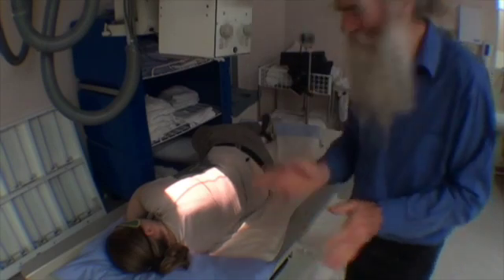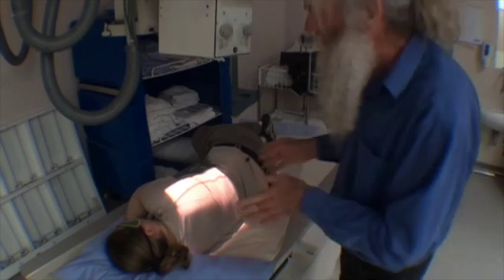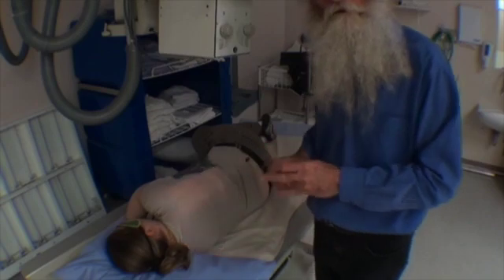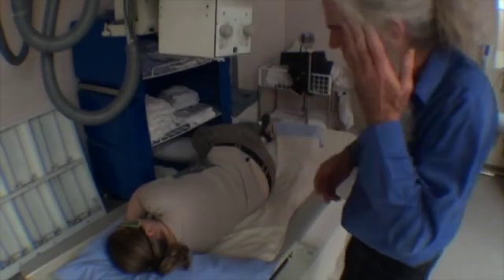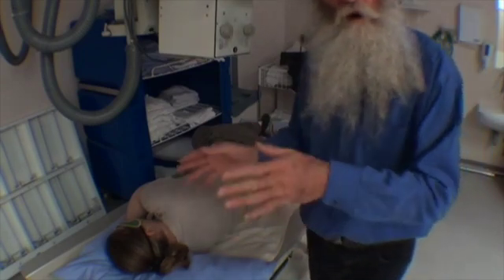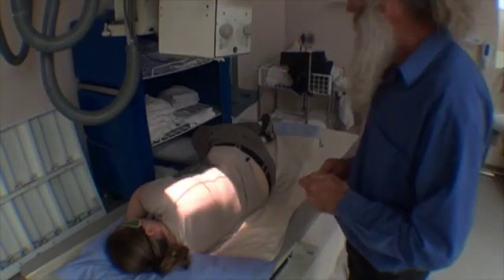So that's my positioning, and I'll show you a series of x-rays that will show you what I'm able to achieve in this position. In this position, I'll actually use an exposure of something like two seconds, maybe three seconds, something like 70 kilovolts and maybe 50 mA, something like that. But it depends with your digital technology as to what you're able to do. But this is the older-fashioned system, and that would be a good x-ray.